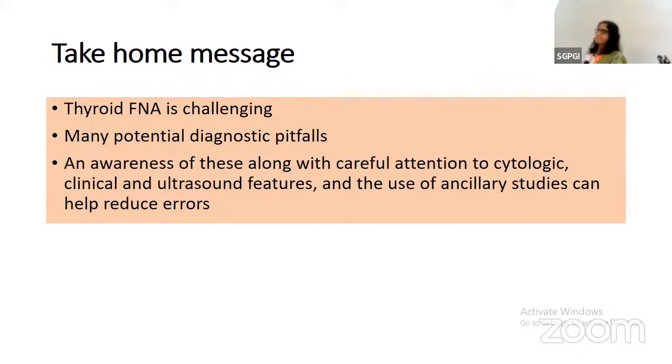I would like to discuss two more conditions which people can probably see in their practices, and it often causes a diagnostic pitfall. One is cystic PTC being diagnosed as a follicular nodule. It happens commonly because in that scenario, the individual lining atypical cell imbibes colloid, and sometimes it starts giving an impression of macrophages.